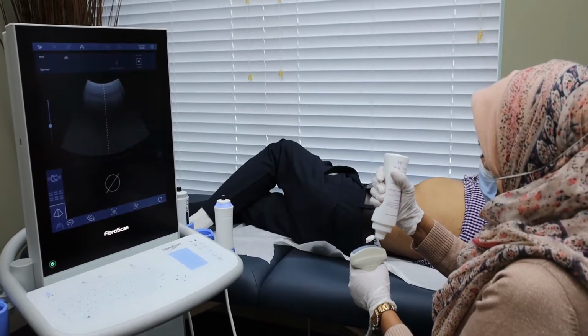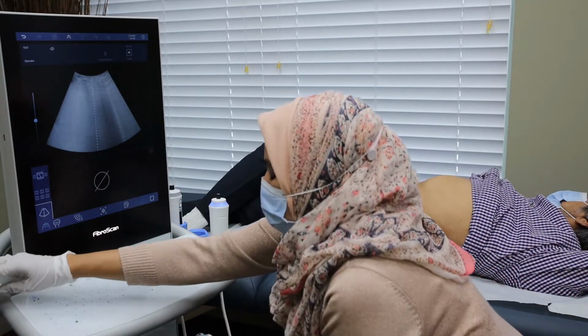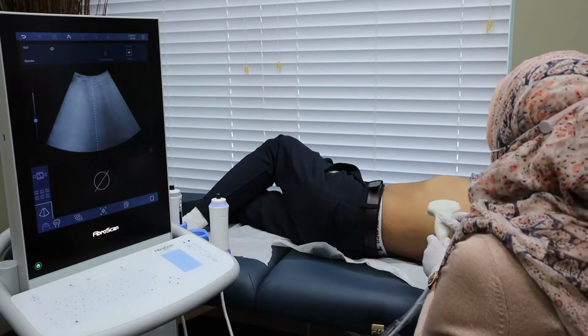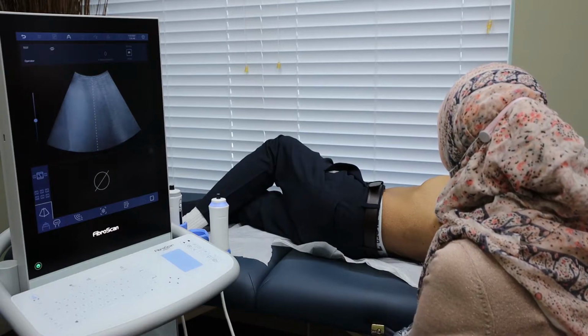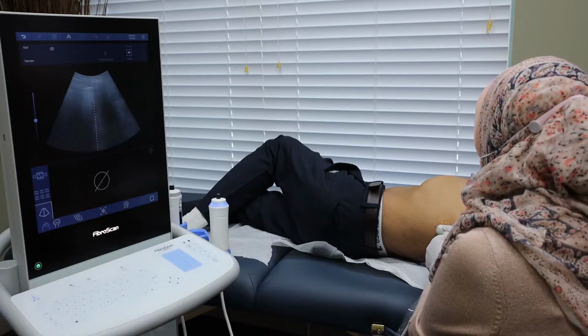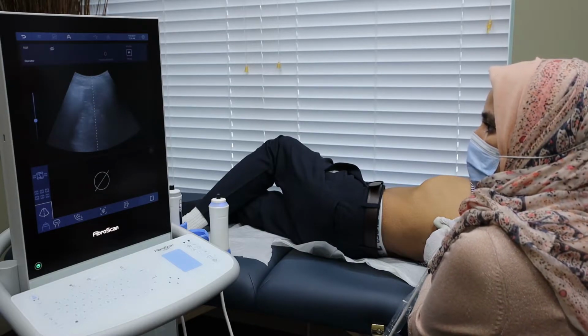After selecting the spleen in the patient's information section, the ultrasound probe becomes active. The vertical line on the side of the ultrasound probe should face the patient's head. The probe should initially be placed vertically on the posterior axillary line at the level of the xiphoid process.